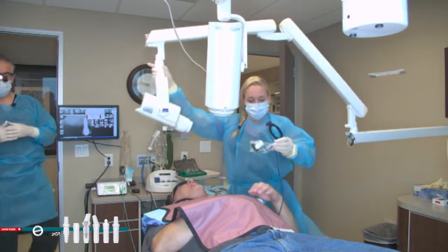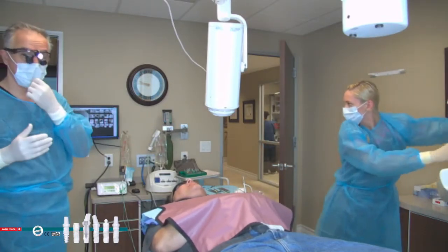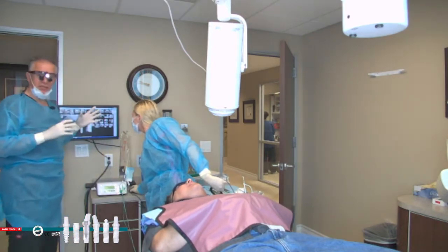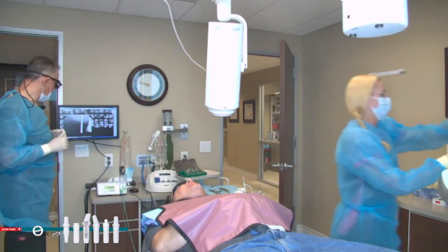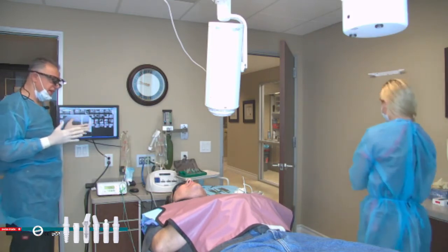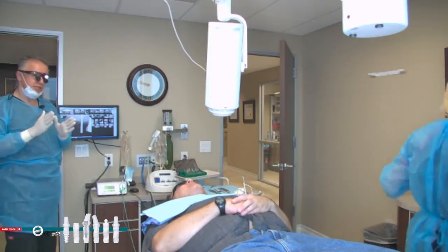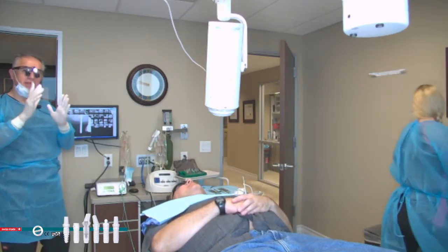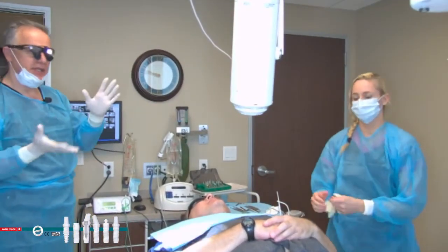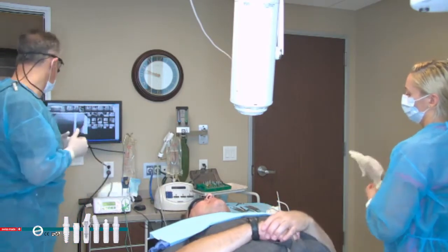Thank you. So radiographically, the titanium and the zirconia implants show a completely white radiopaque image on the X-ray, and the Z5M, which we'll see later, will show as a solid cylinder with parallel threads. Because it's one piece, it will show the abutment right attached to it. There's no micro gap, so there is no concern about bacteria getting into the gap.